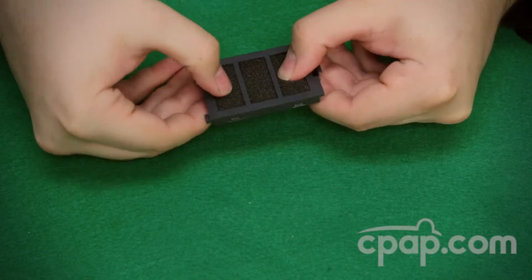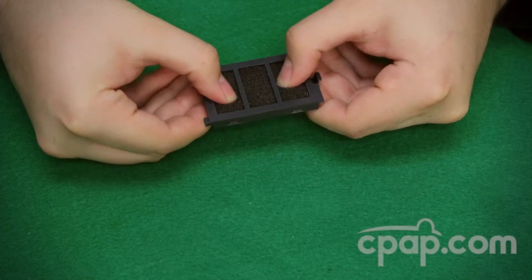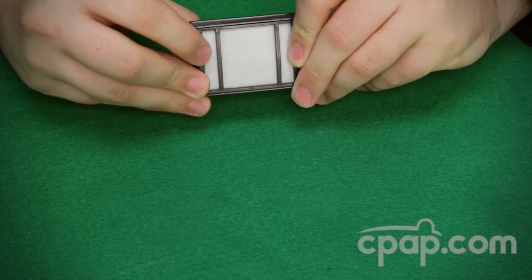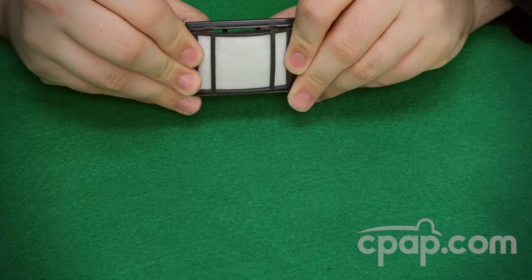Place the balls of your thumbs against the black foam filter. Then, while holding the opposite side secure, push with the balls of your thumbs to disassemble the cassette.